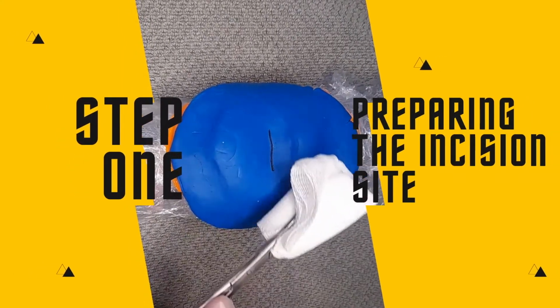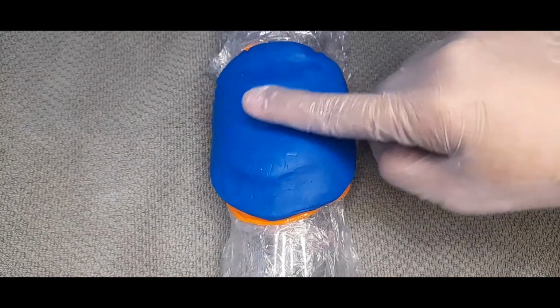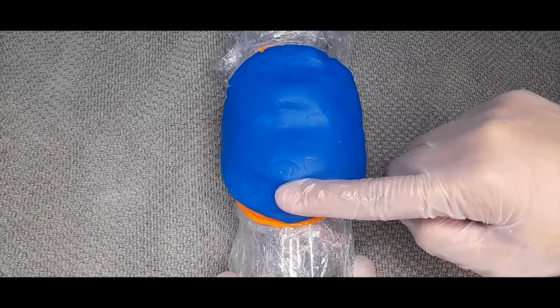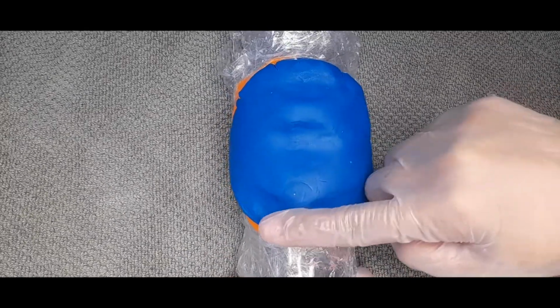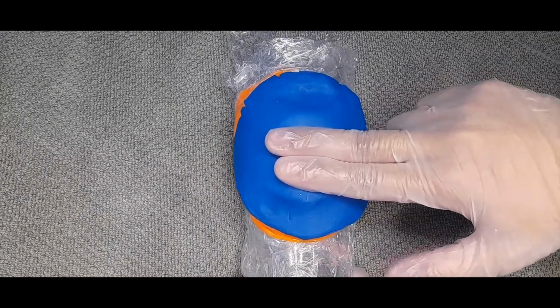Step 1. Preparing the incision site. Place the patient in a supine position with the neck extended by a pillow or bag placed under the shoulders to deliver the trachea out of the thorax and to allow adequate access to the cervical trachea.